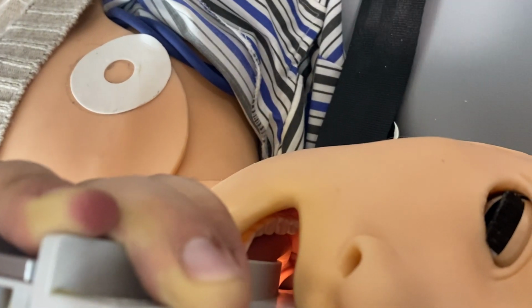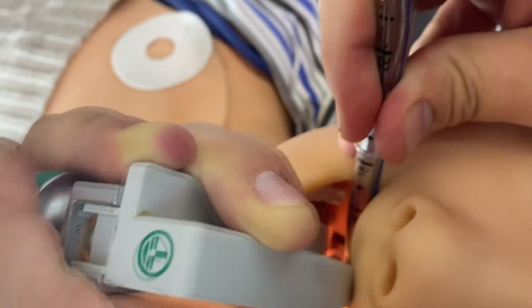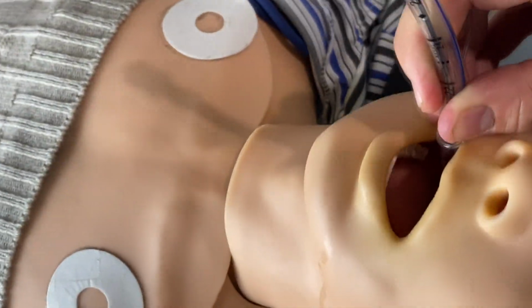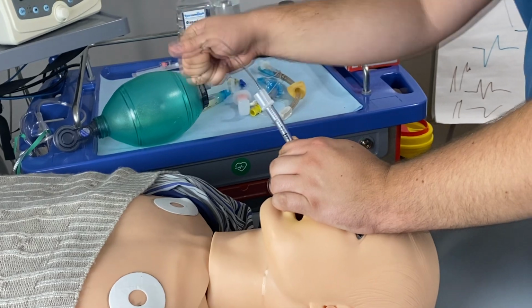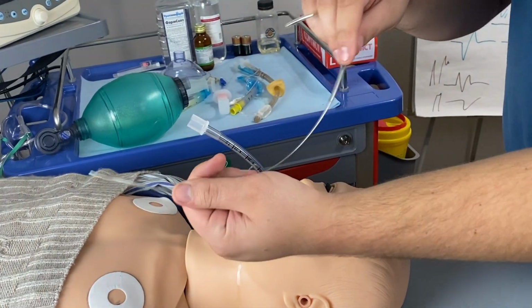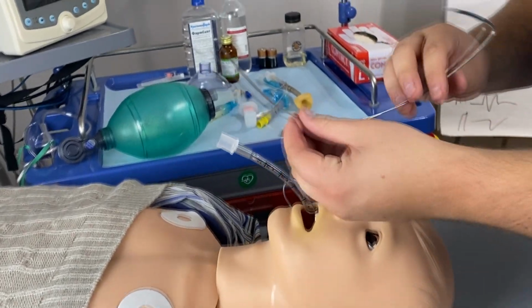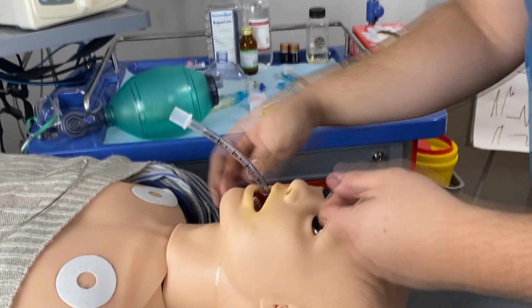And now I'm taking the tube and I am placing it between them inside the hole. Then I remove the laryngoscope, then I'm removing the introducer, which is a wire that is used to give it a more sustainable shape. This is a metal wire, it can also be plastic, doesn't matter.